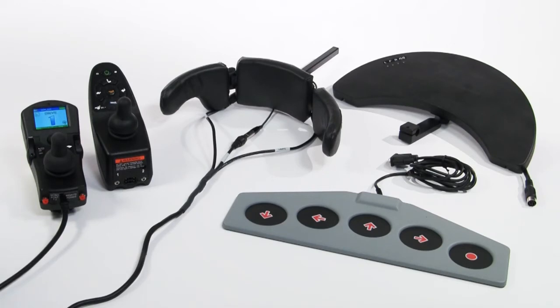There are 2 primary ways to drive at different speeds when using a switch driver control. One is by using latched driving, another video in this series. The other is by simply switching to a different drive profile that's programmed for a different speed.